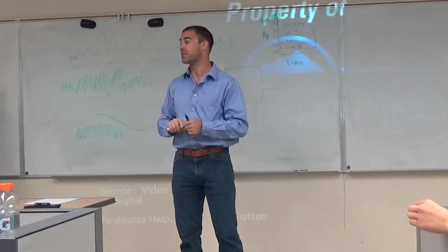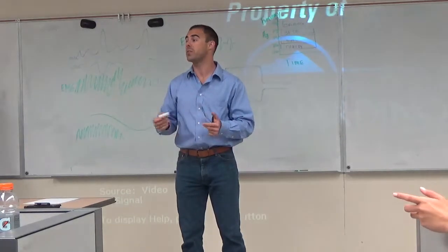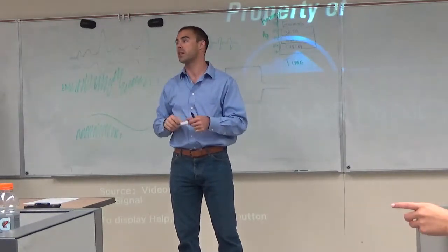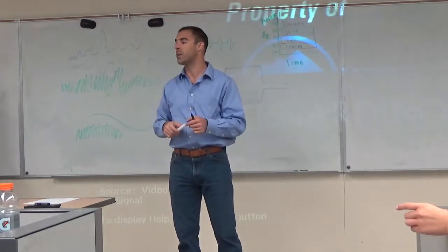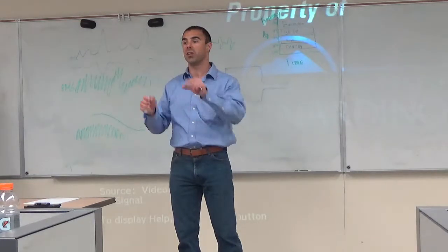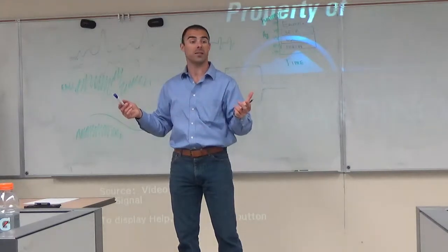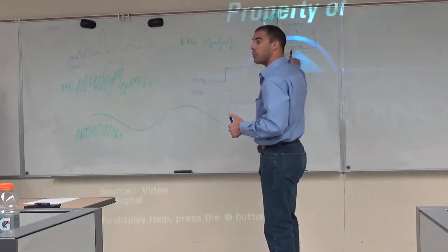That's very fast. And even if they did, we would not be able to measure it because when we record, we also record electrical magnetic activity coming down from the lights. And they tend to oscillate at about 60 hertz. So that's the hertz of the line of electricity from the light. So that's one more artifact we can add to the mix. Okay, does that help?